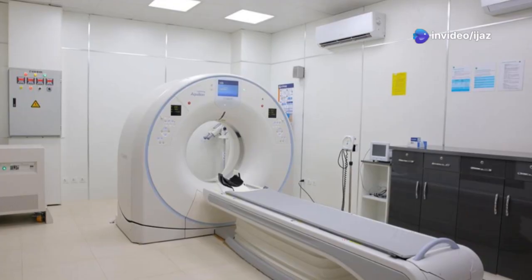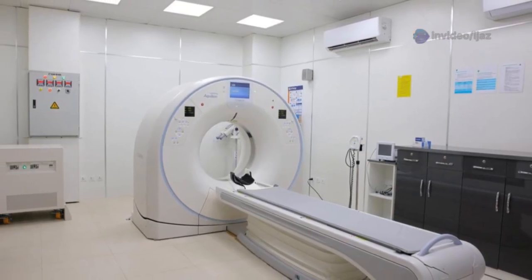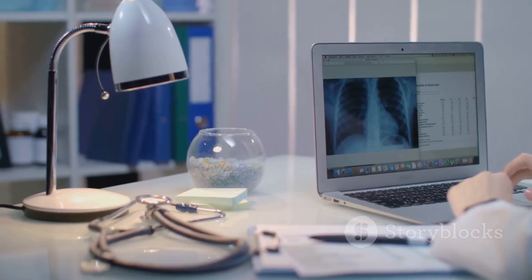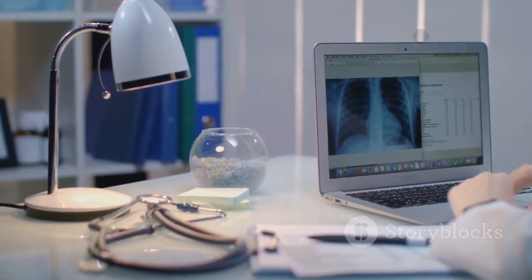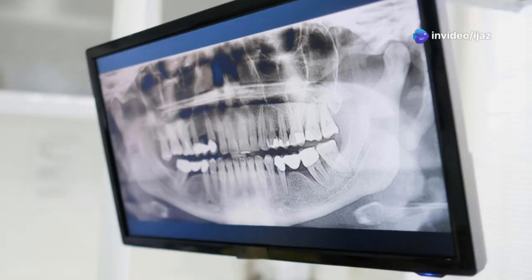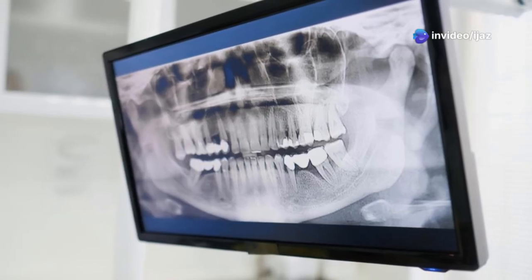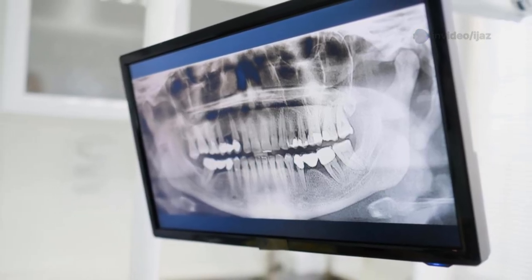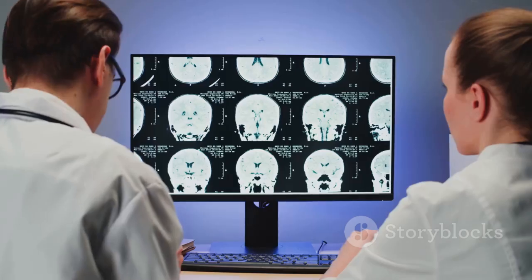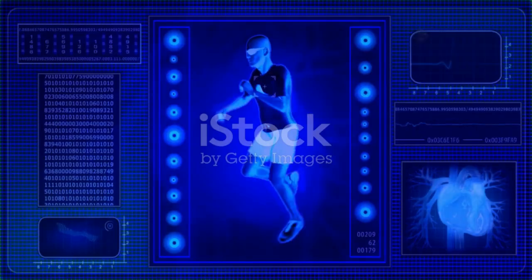These detectors could convert X-rays directly into digital signals. This meant images could be viewed almost instantaneously on a screen. The darkroom started to become a relic of the past. The advantages of digital X-rays were numerous and significant. Image acquisition became much faster. No more waiting for film.